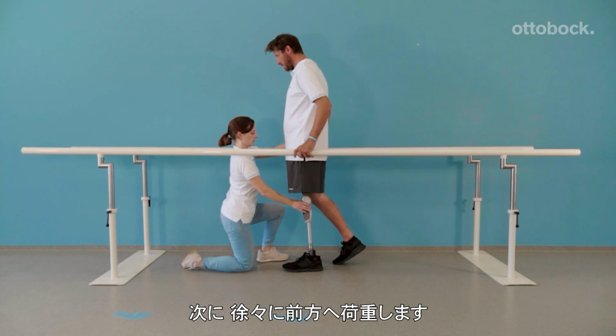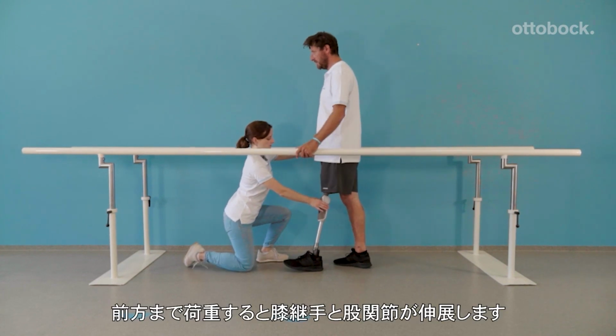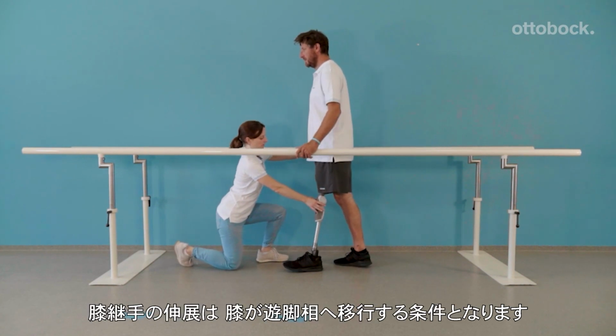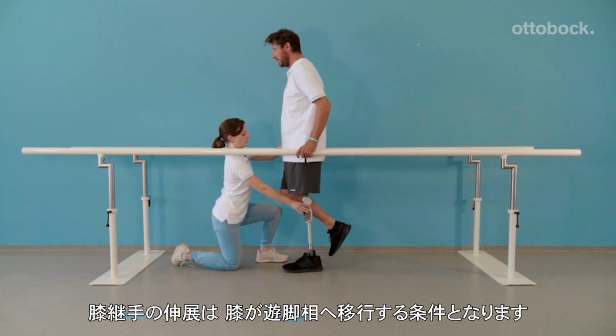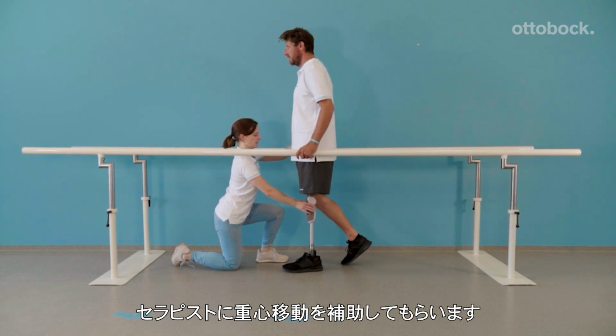Here the model learns to shift his center of mass over the prosthetic foot. This pattern causes knee and hip extension in terminal stance and is a basic prerequisite for stance release of the knee into swing phase. The therapist guides the weight shift through the entire stance phase if required.